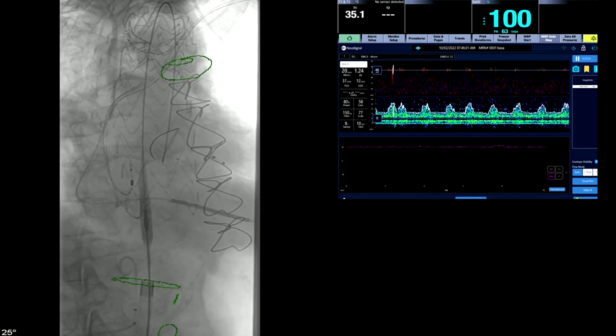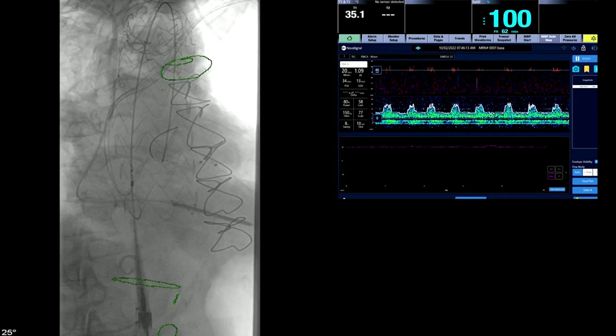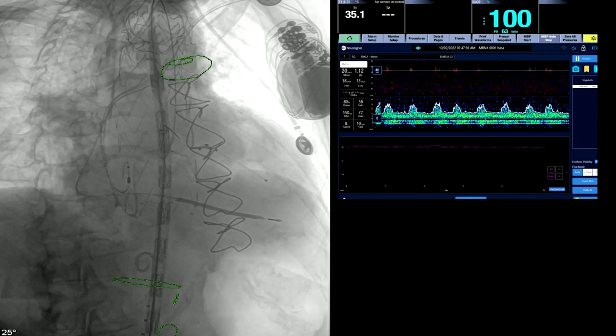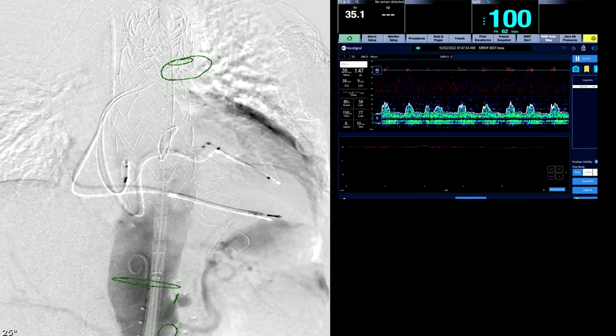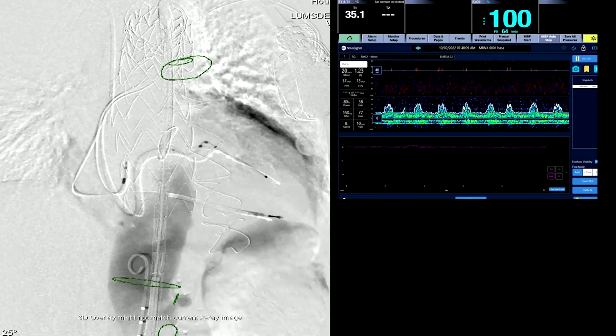This patient had a spinal drain placed preoperatively. Here's the third piece — we planned three pieces but ended up needing four. Now you can actually see the origin of the celiac, which is a little stenotic. Now we get a better view of it.